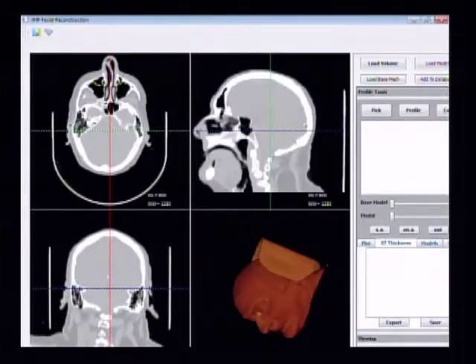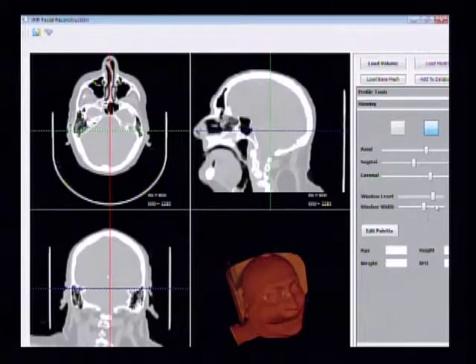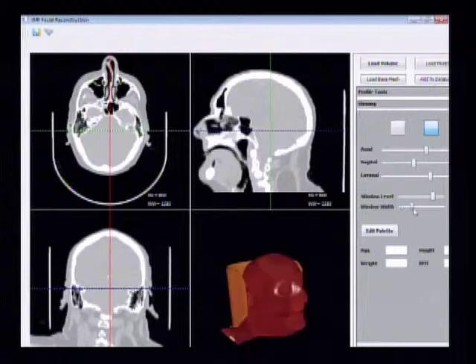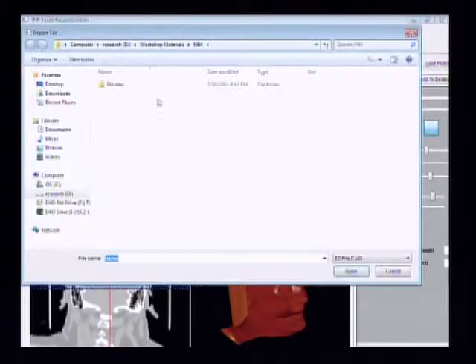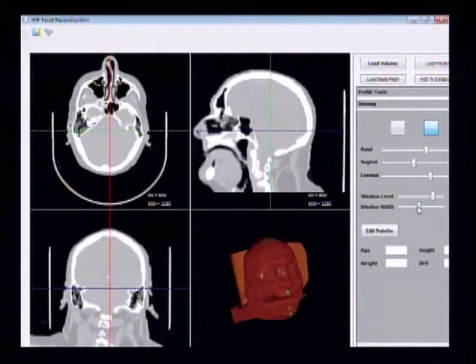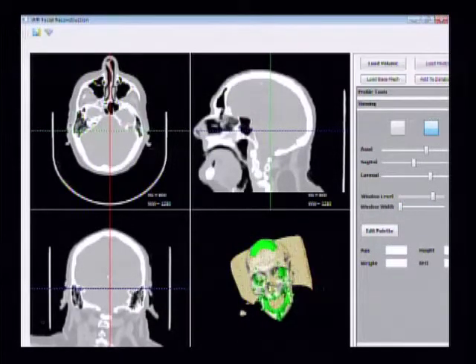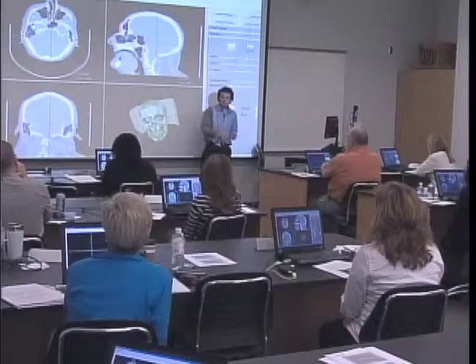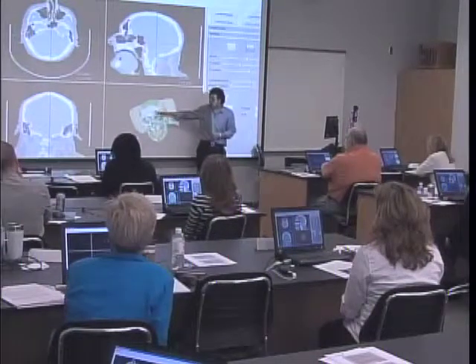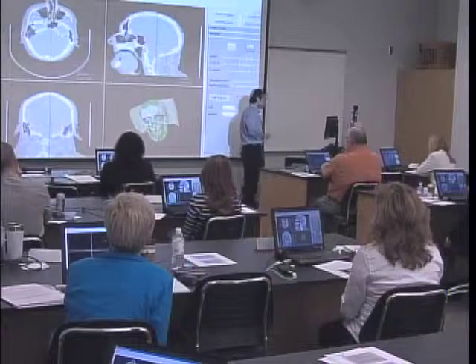We load the segmented surface.iv, and what happens is it overlays the model on top of the volume. So you can see here the segmented model and the volume as well. Then we're going to load the base mesh, which is under workshop material. There is a file called baseskull.stl. Once you open this, it overlays the base skull on top of the other skull and registers them together. The green one is the template skull that has the 32 fiducial markers, and the white one is the bones that you just segmented in the previous session. They are registered together so that it shows you the location of the fiducials to help you do your point selection.